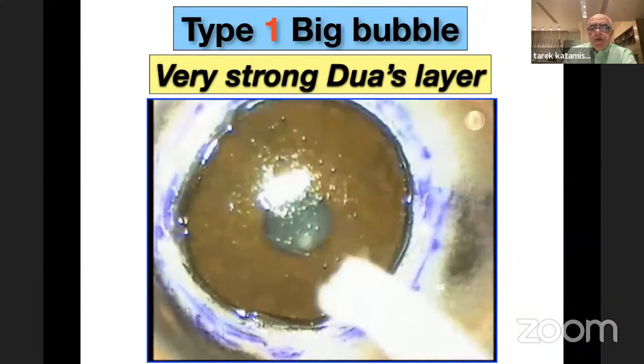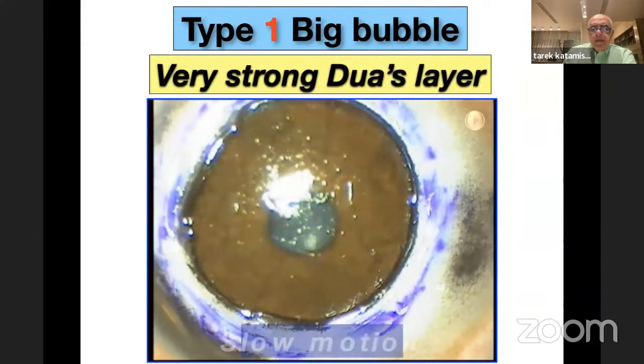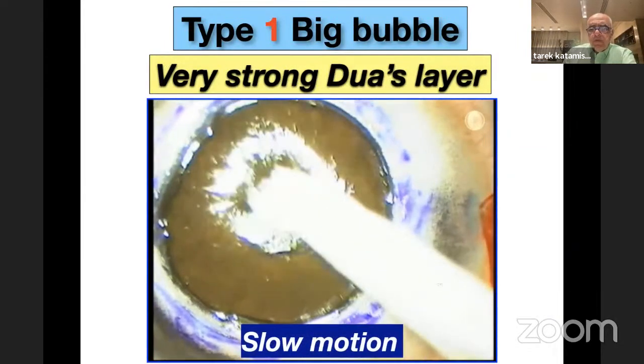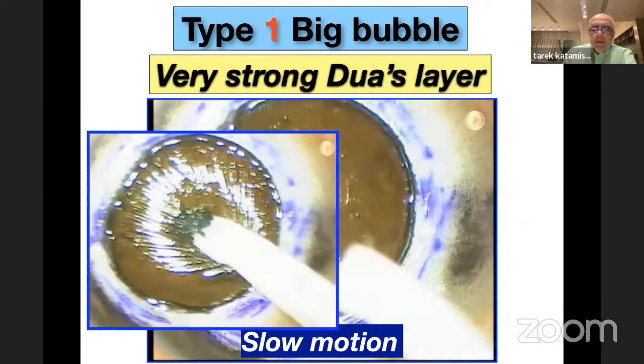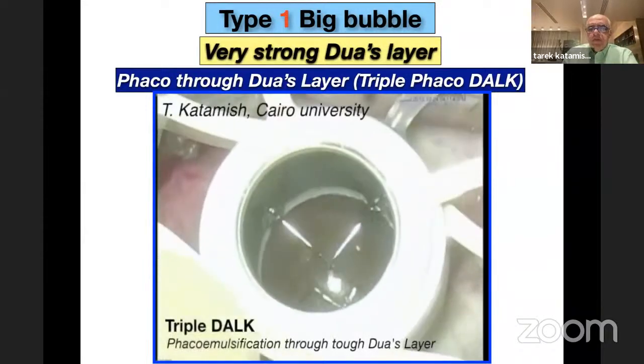Dua's layer is very strong. It can withstand the pressure, as you see. This was done by mistake. You see how much pressure is applied over Dua's layer, and still it resists rupture. So this is very characteristic of Dua's layer. You see? That's why this phenomenon has encouraged me to do what I call triple phaco DALK, doing phacoemulsification through this tough Dua's layer.